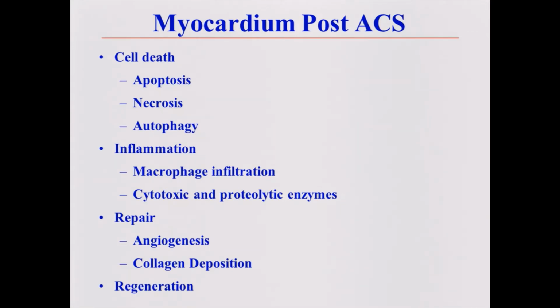And what's really wonderful about it is we get a very nice contrast during an acute coronary syndrome between infarcted myocardium and normal myocardium. The myocardium forms its own control, the normal areas of the myocardium. And there are a lot of processes that we're interested in. Matthias alluded to cell death, and this can be due to apoptosis, necrosis, or autophagy.